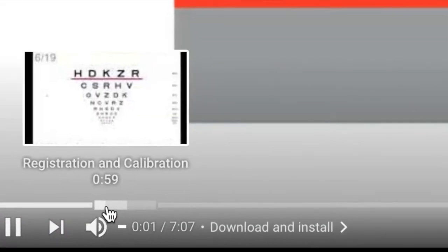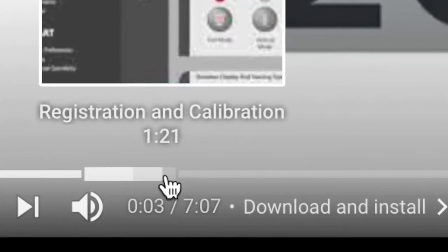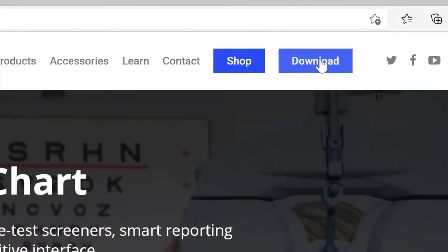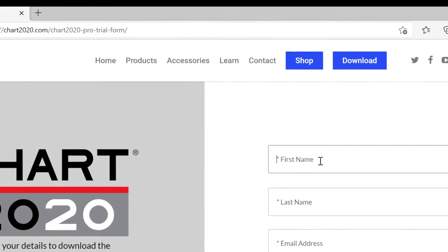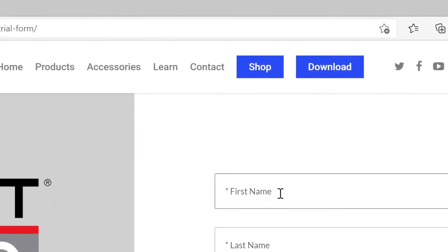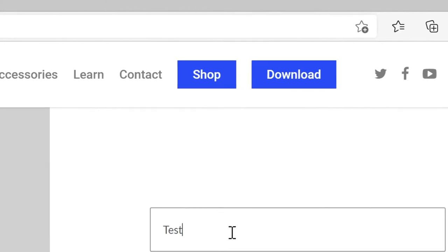This video is divided into chapters, which you can see by hovering over the YouTube control bar. These chapters allow you to skip to the section that you are most interested in learning about. Download the software from www.chart2020.com by pressing the Download button on the right-hand side of the website.